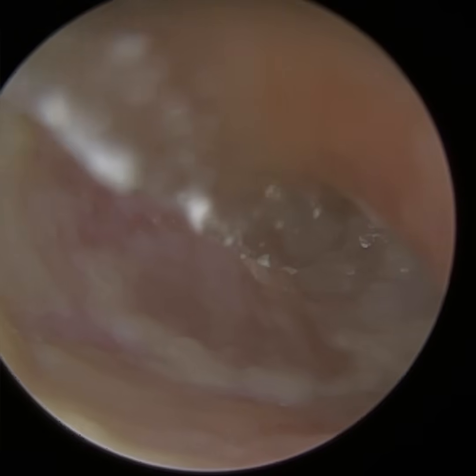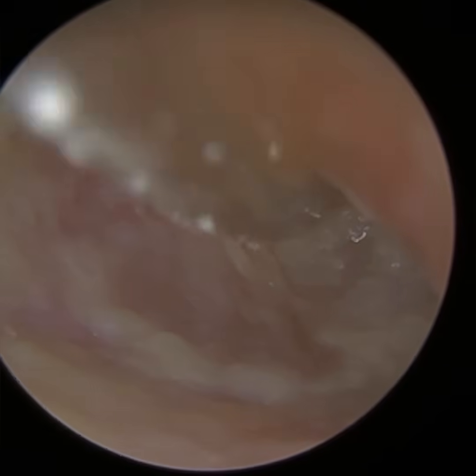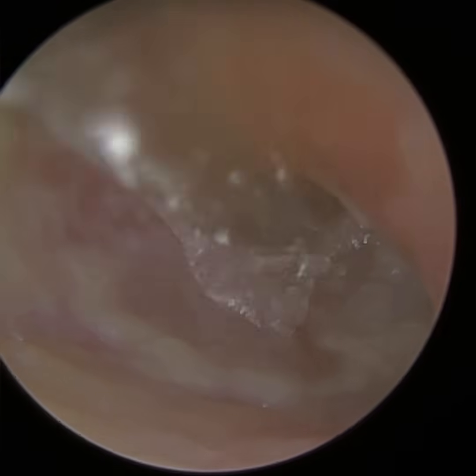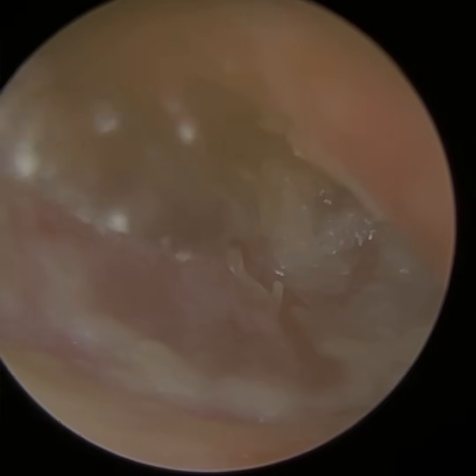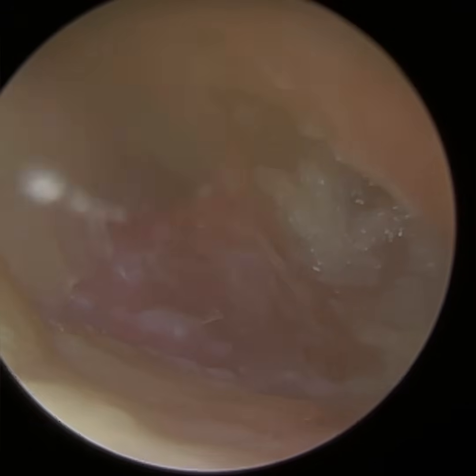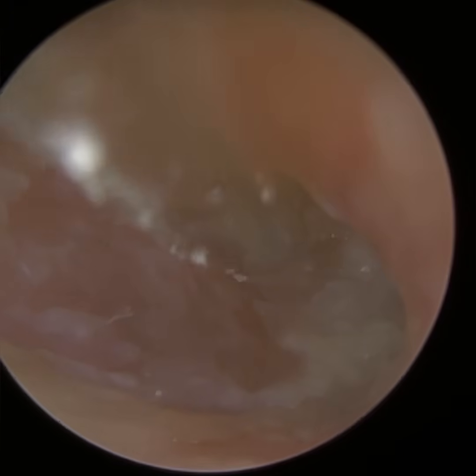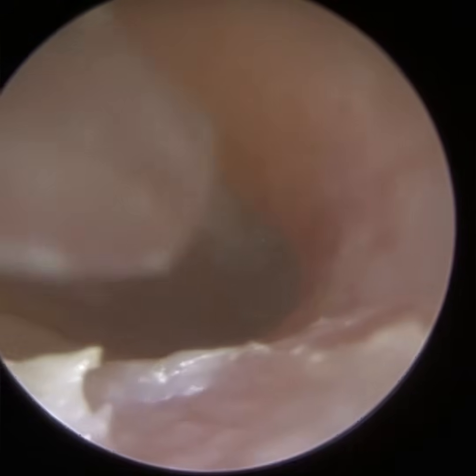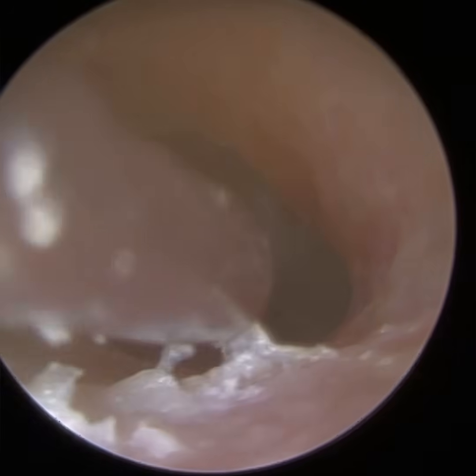And there's different types of otitis externa. So you can get superficial otitis externa, where it's just affecting probably the most outer layer of skin, the epidermis layer, and quite often with that you don't really get any inflammation. You may get itchiness of the ear and a bit of erythema, but here we have got some edema. So when you've got some edema, some swelling, and you can see it's quite red and it's inflamed, we know it's probably affecting the inner 2/3 of the ear canal.